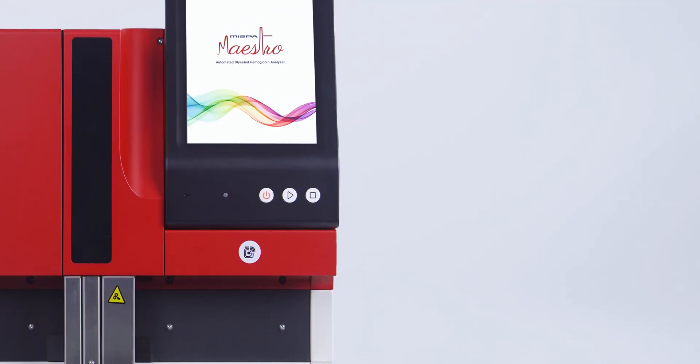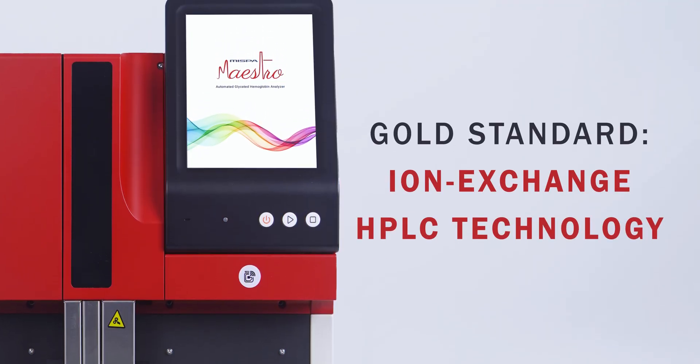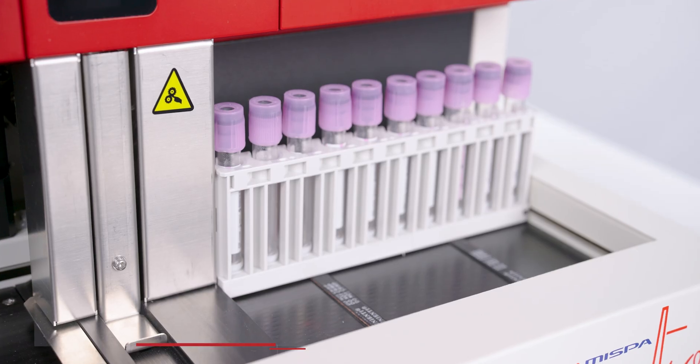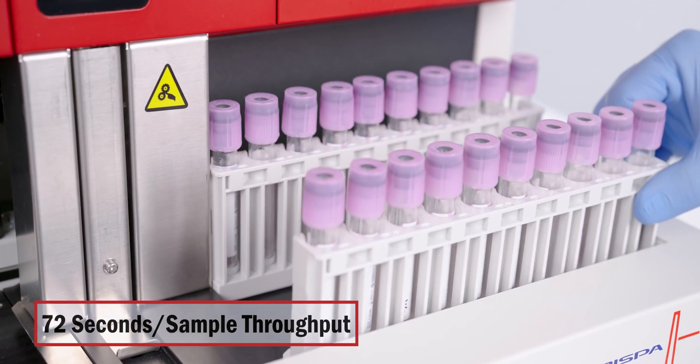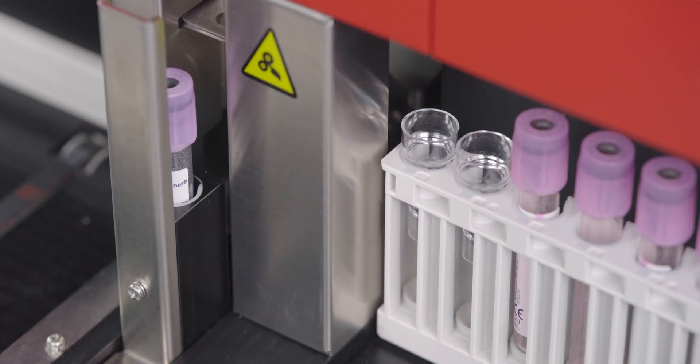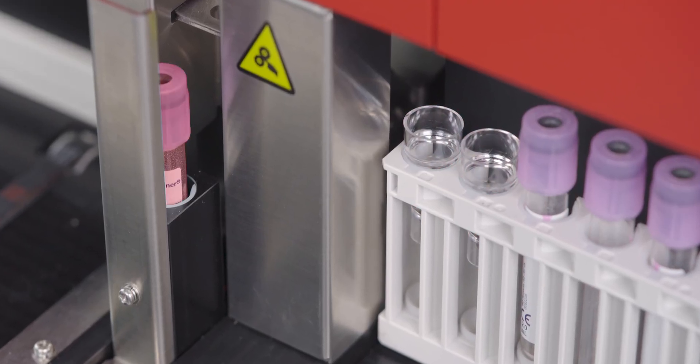MISPA Maestro delivers precision, backed by its gold standard ion exchange HPLC technology. It can process up to 50 samples at once in both whole blood and pre-dilution modes, supporting blood collection tubes, sample cups and even emergency samples.